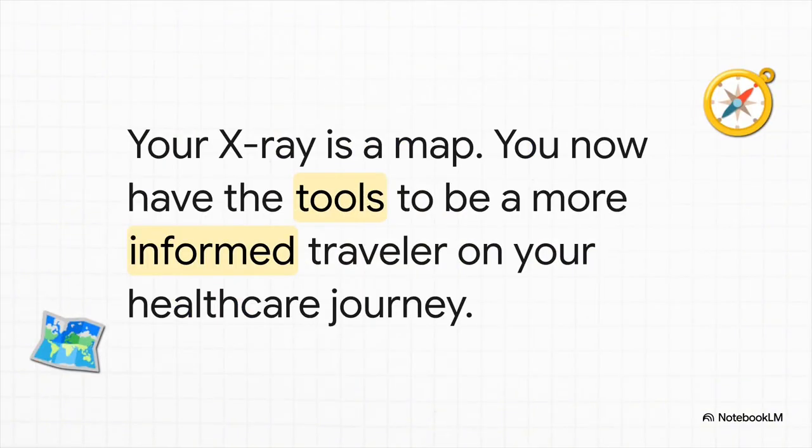Look, the goal today was never to turn you into a dentist. It's about making you a more confident, informed patient. Think of your X-ray as a map. And now that you understand the basic language of light and dark, you have the tools to follow along, ask smarter questions, and be a real partner in your own healthcare journey.